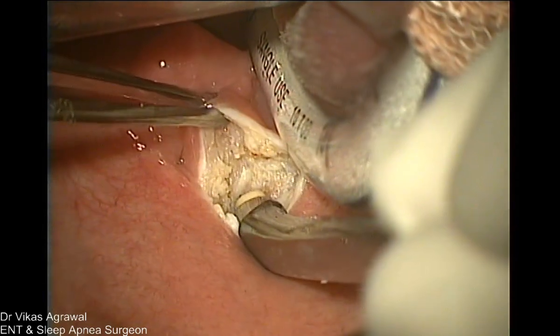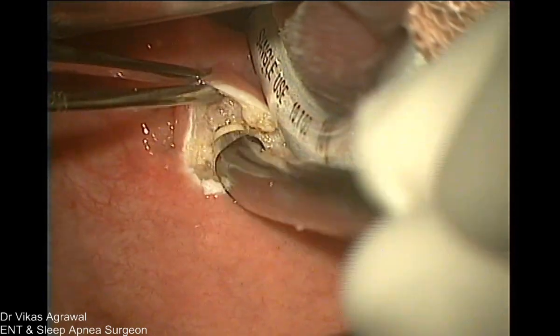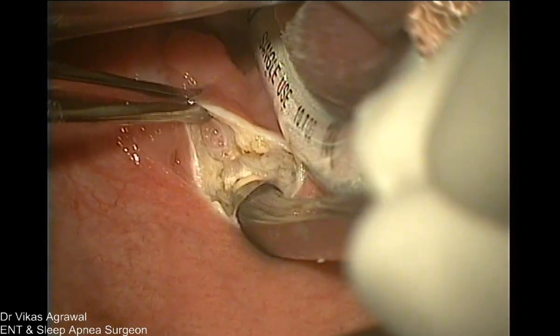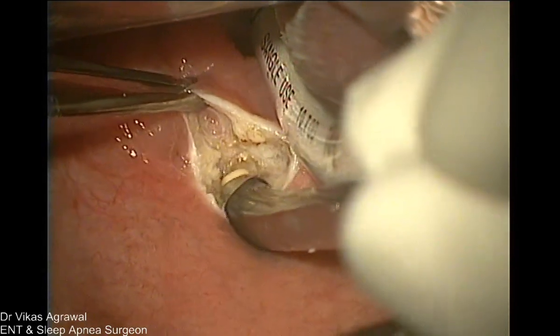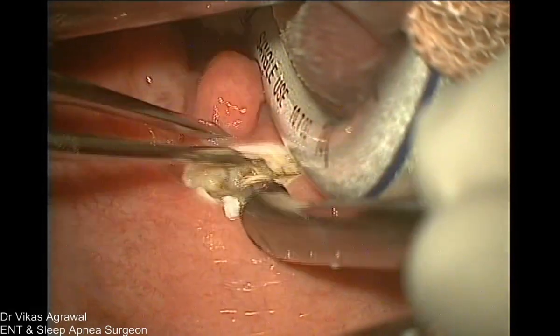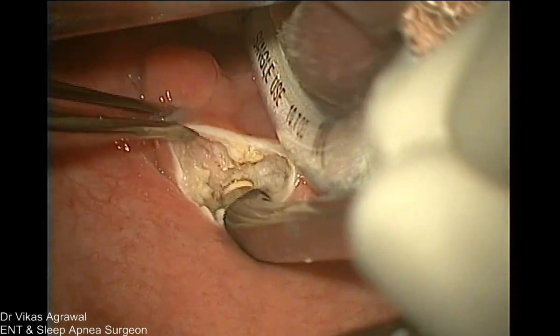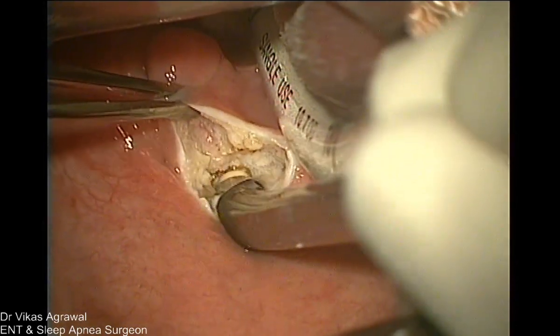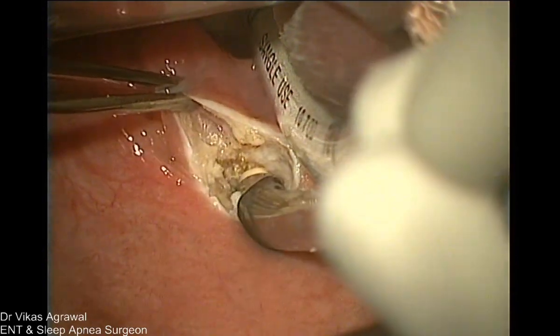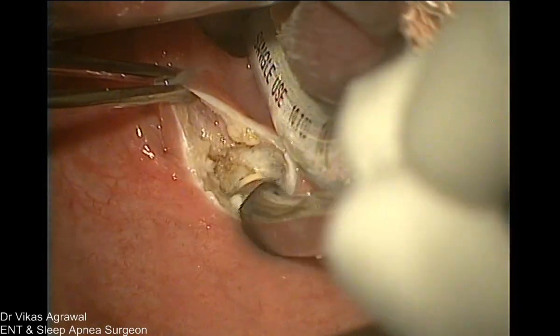Can you see the musculus uvuli very well? Yes, seen very well. These are the fibers going down. So I am cutting the musculus uvuli in the midline. Now, this much, if you see at the drug-induced sleep endoscopy, it's not the tip of the uvula, it's the base of the uvula. And this is the base of the uvula which is coming out. Very nice picture, isn't it?